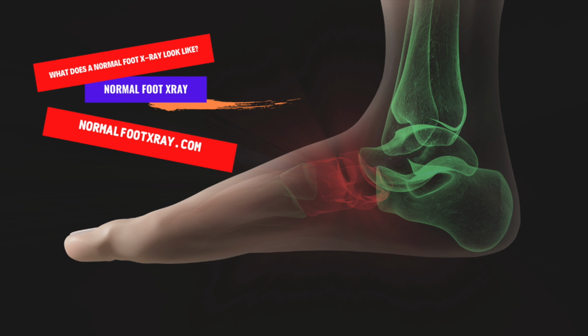Typically, a foot X-ray will show 3 pictures of the foot, taken from different angles. X-rays of the foot are used to diagnose various problems. It can identify fractured bones and dislocated joints, and it can help determine whether the bones in the foot are aligned properly and healing. It is also used to plan and evaluate surgeries. It can detect tumors, cysts, and other early stages of bone infections. Despite its limitations, a normal foot X-ray is useful for diagnosing several common conditions.